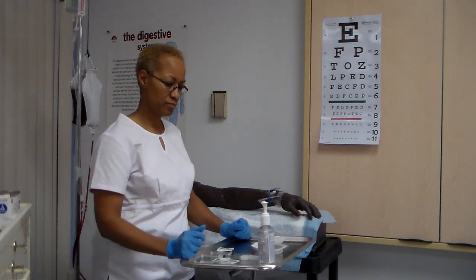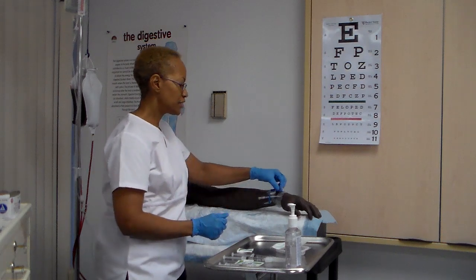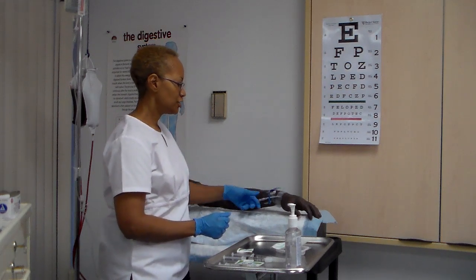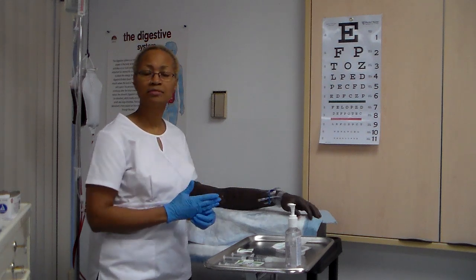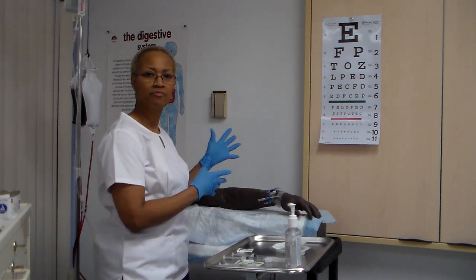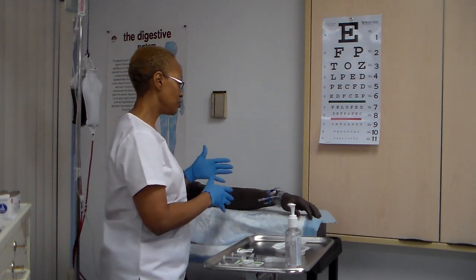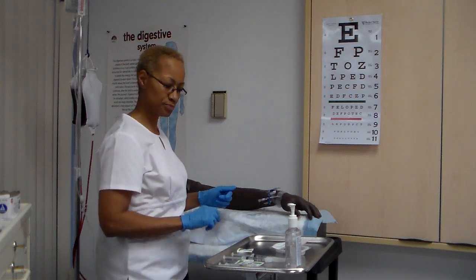Administering medications by IV push. Okay. So now we're going to provide a medication just through a lock. So it's no infusion running, because sometimes you'll have clients who have just a hep lock because they're taking enough PO, they're taking enough by mouth that they really don't need fluids constantly running. So therefore, all you're going to do is just provide this medication. Okay?